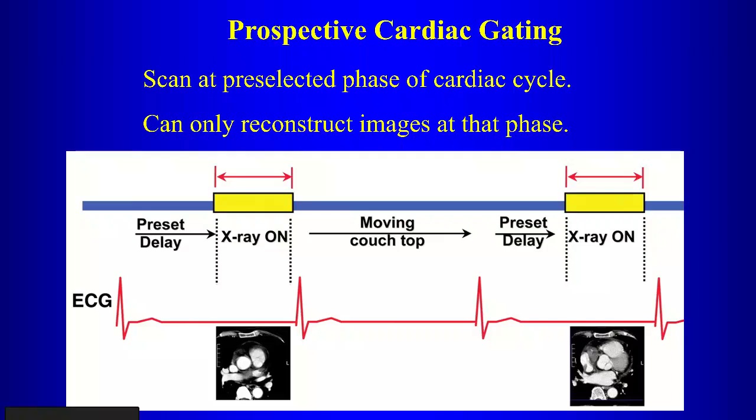Remember I said that a lot of the literature on coronary artery calcification was done using the electron beam scanners, the older scanners. And that Agatston scoring system has been around since the very beginning. A lot of the data that we have on prognosis and the significance was done using that scoring system, which uses 2.5 millimeter thick slices. That's why, given all the techniques we have, we're still looking at 2.5 millimeter thick images when we're doing coronary artery calcification scoring. Okay?